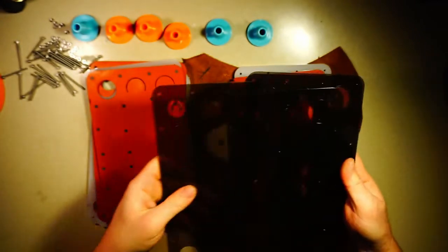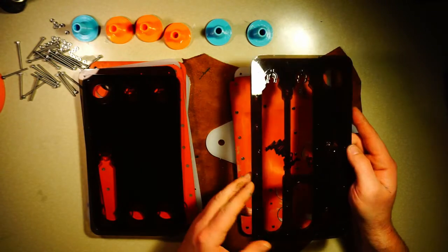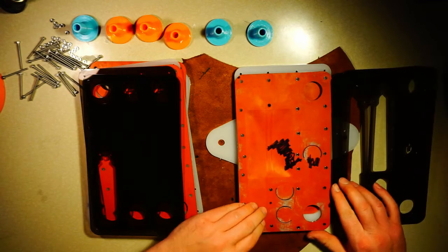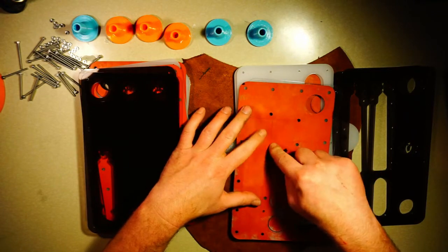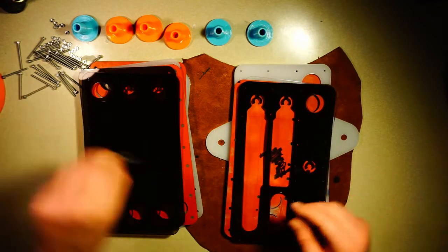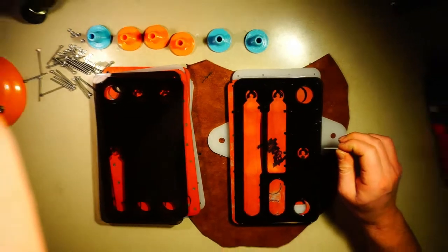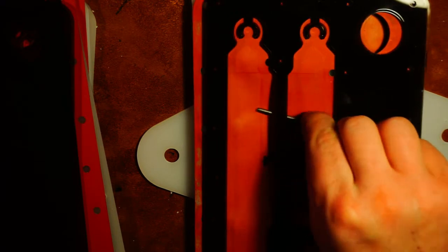acrylic. However, underneath it, which is backwards from the way we presented it in the diagram, there's a flexible membrane here. Let's just put these aside here. This flexible membrane can be pushed this way to expose the patient to the PEEP like this. Let's see, a screw. You can see that even when everything's together, you can put an object under there. Let's zoom in. Here we can see you can slip a screw underneath that side.